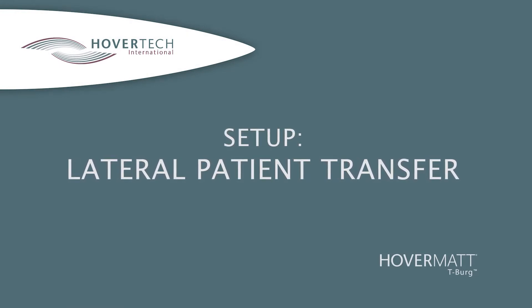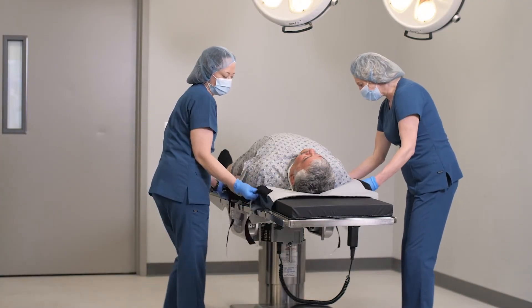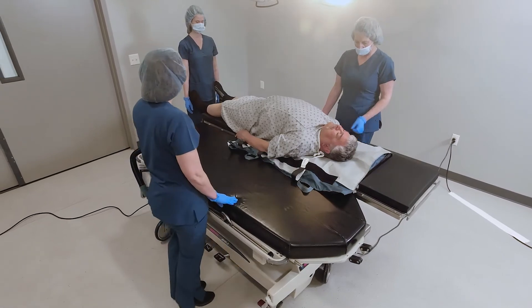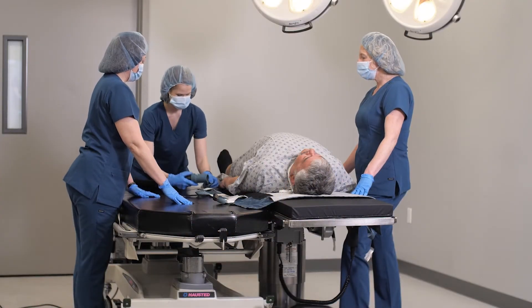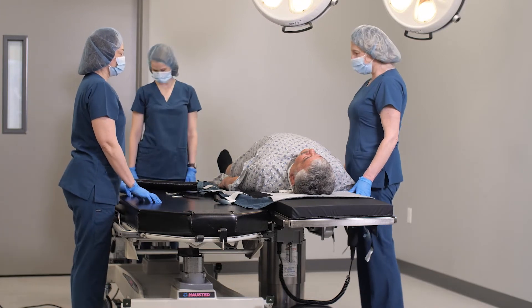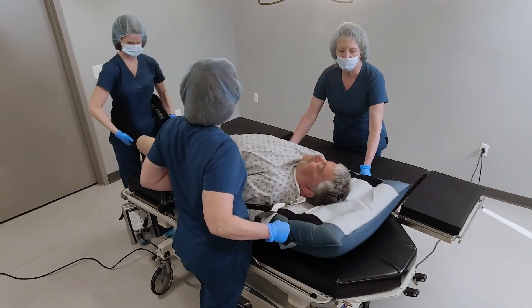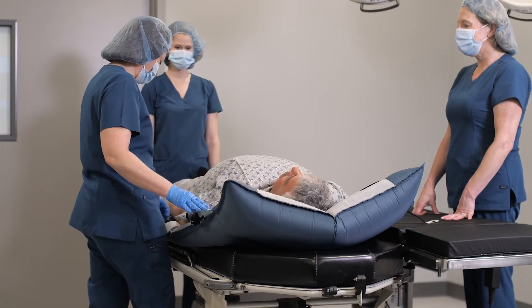To perform a lateral transfer from the OR table to a receiving surface like a stretcher, begin by disconnecting the Hovermat T-Berg from the OR table. Make sure the stretcher's wheels are locked prior to performing the transfer. At the bottom of the mat, insert the air supply hose into the air hose port located on the same side to which the patient is being transferred. When the caregiver next to the patient has assumed the position of safety and given the signal that it is okay to inflate the hover mat, initiate airflow using the hover mat 28-34 button. Transfer the patient from the OR table to the stretcher. Once the patient is on the stretcher, ensure they are centered. Turn off the air supply and remove the hose. Ensure the stretcher's rails are up.